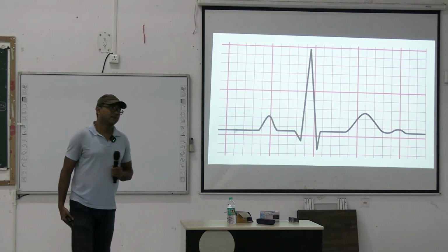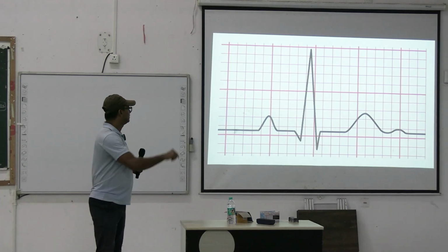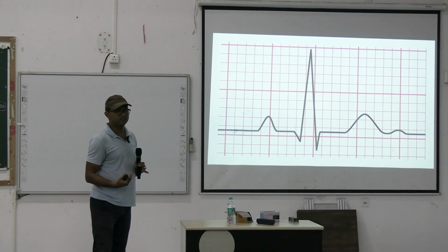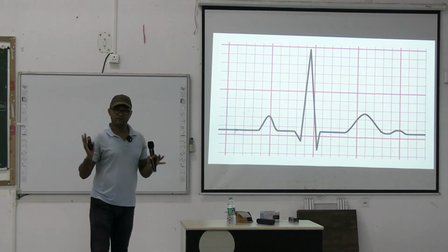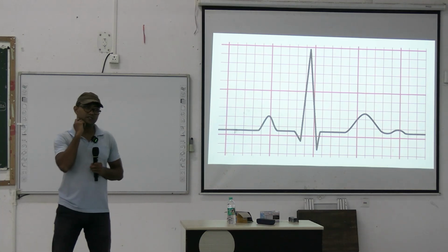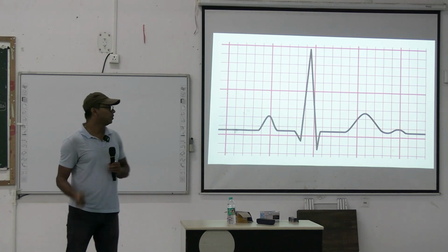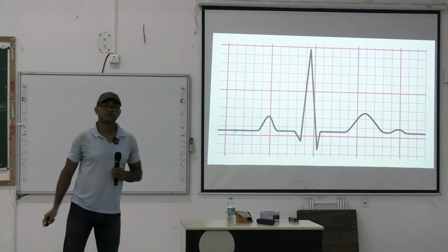Okay. So, if I ask you what is net QRS voltage, your answer should be calculating all the waves in the upward direction and downward direction, positive, negative, and you get the net QRS voltage. Okay, why is net QRS voltage important to measure? Tell me when QRS voltage will be higher, more positive.